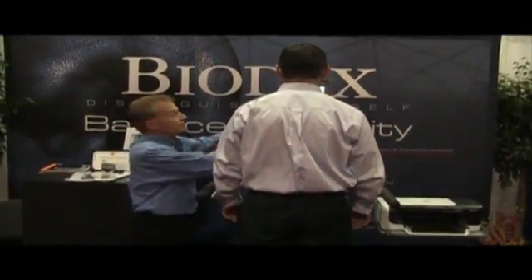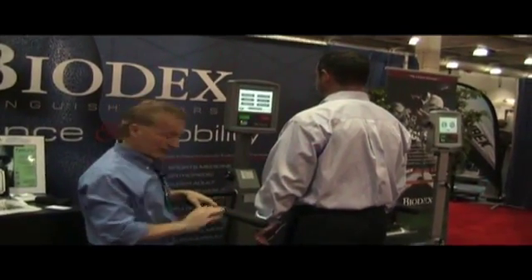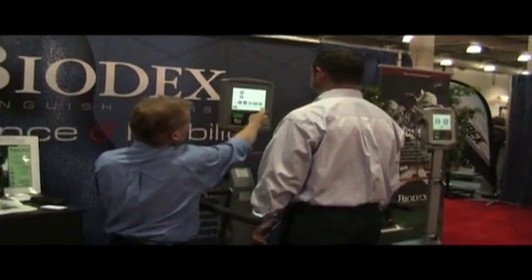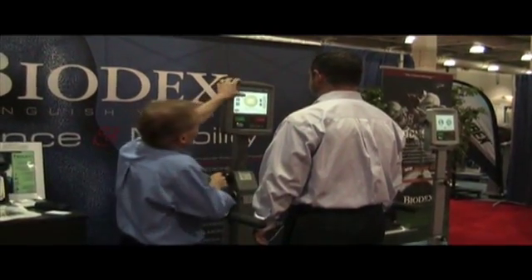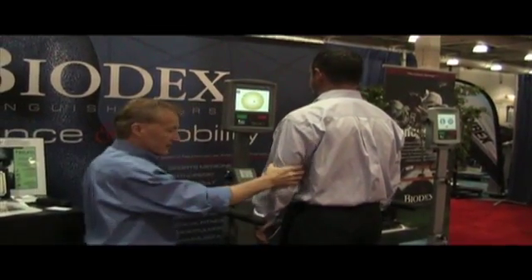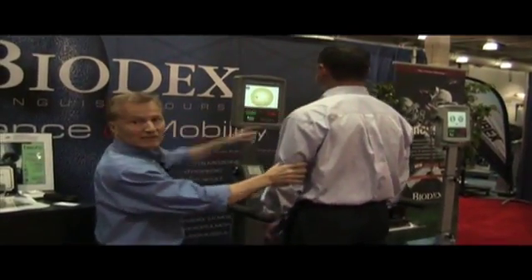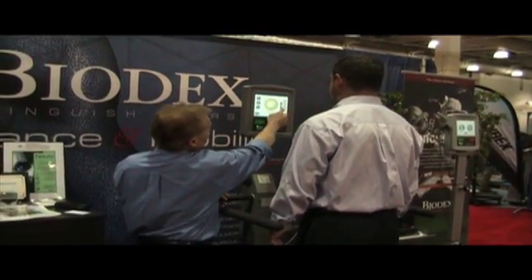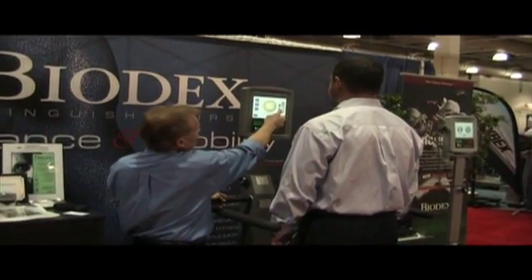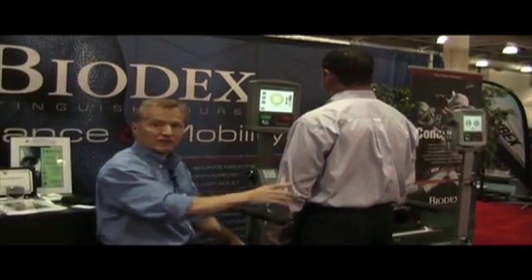It's a simple to use touch screen display. We're going into a training protocol right now to demonstrate how the product works. As the patient moves their center of balance, their icon is represented on a screen showing the position of movement. We can set up training protocols where we can loosen the platform and challenge the patient to keep their balance on an unstable surface. As you can see, the platform is now moving.